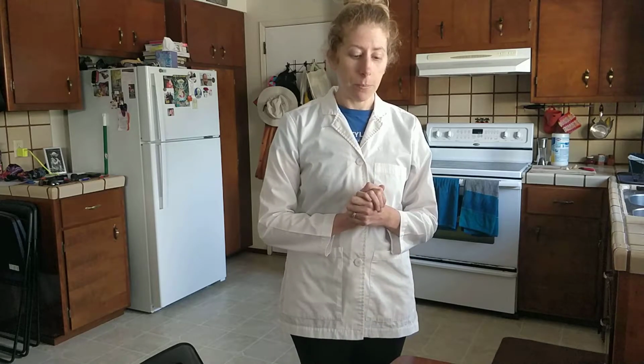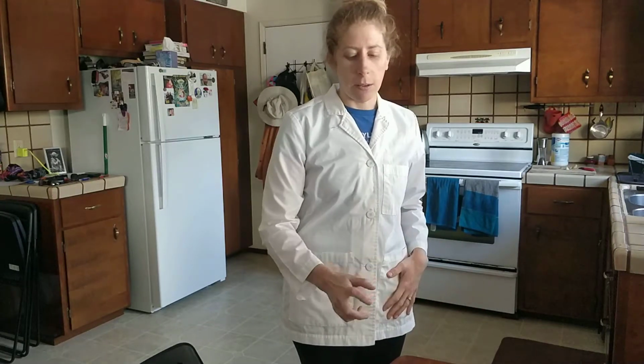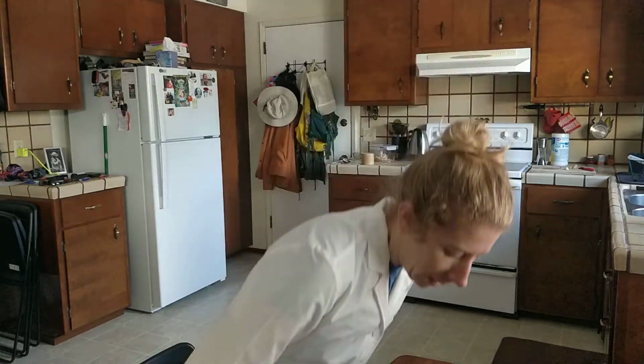I will assess their IV site for any infusion reactions, phlebitis, and patency. Then, if all of that looks good, I will scan the patient's wristband and I'll scan the medication to be administered, which is the second check of safe medication administration. Then I will prepare the medication.